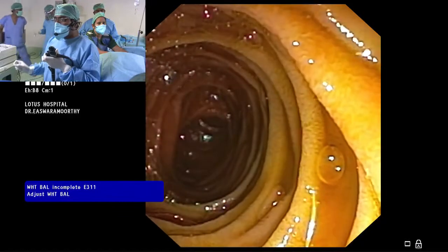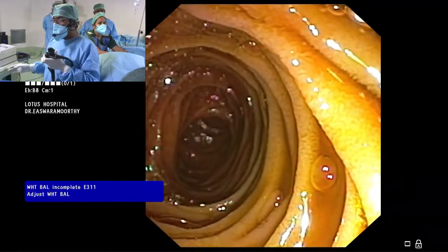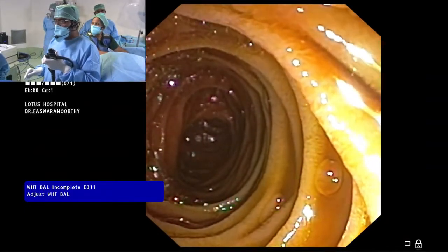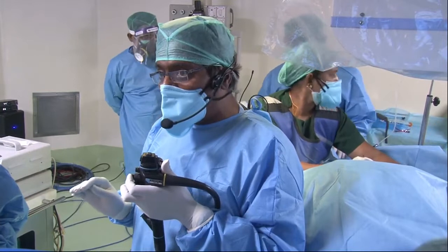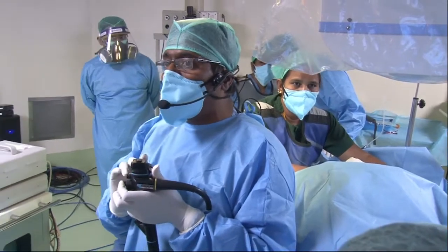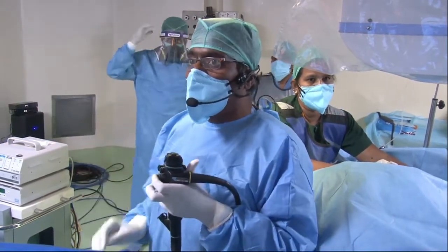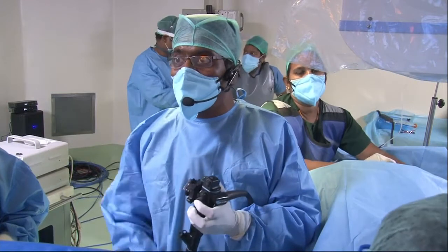So the debate is whether you do MRCP, then go for ERCP, perfectly right, nobody will question. Or if you have EUS, you do EUS and then go. I chose this already because this patient has been waiting because of the COVID for nearly 2 weeks without relief of pain, persisting pain. The LFT actually increased. The only difference is no bilirubin. Bilirubin is normal. So I have a gut feeling this patient can save money on this MRCP, which is purely diagnostic. We can go. That is the only thing. This is what we preach, maybe slightly different from what I practice because of the cost implications.